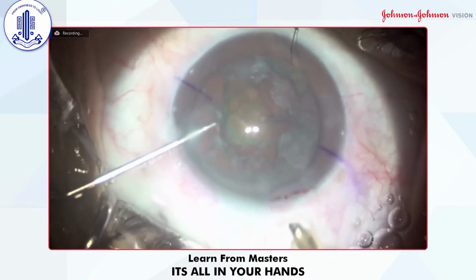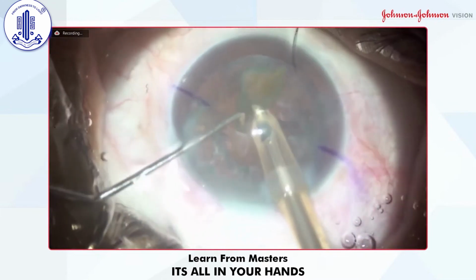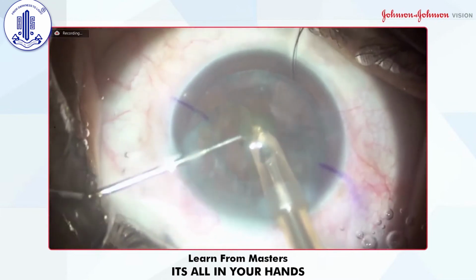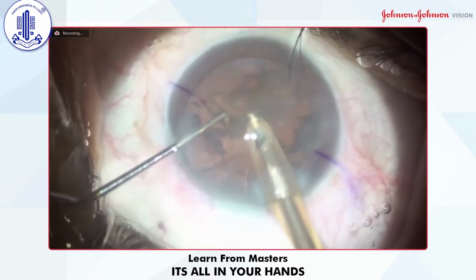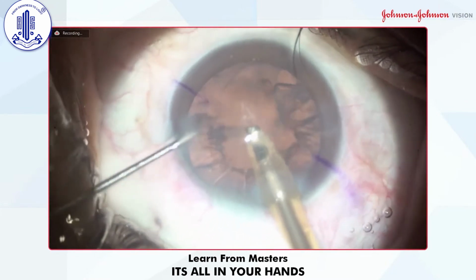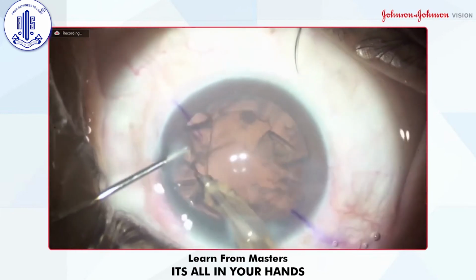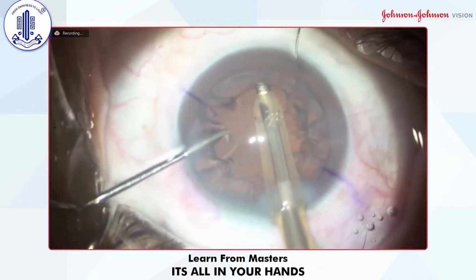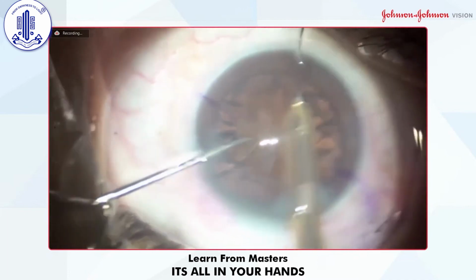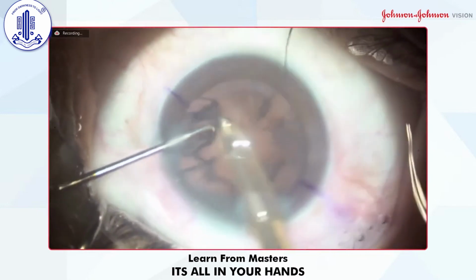Okay, so you can see that I've reduced the Phaco power by making the two halves of nucleus by specially designed chopper. Use very low vacuum for engaging the epinucleus.